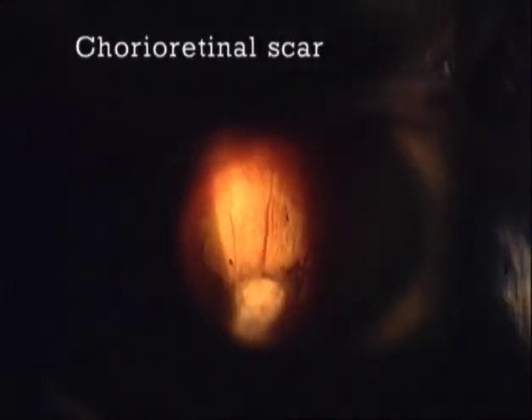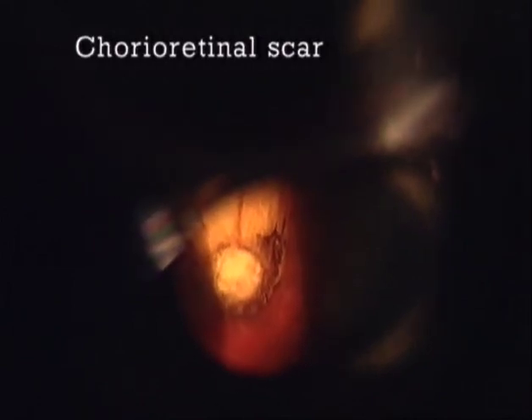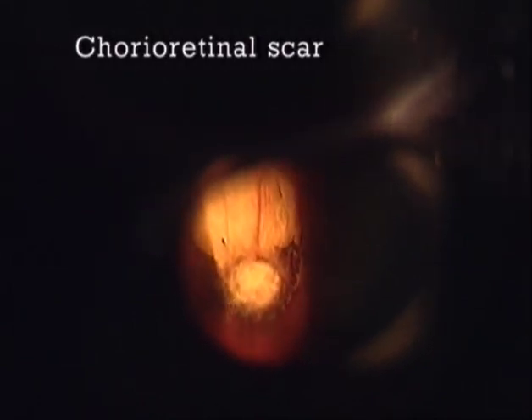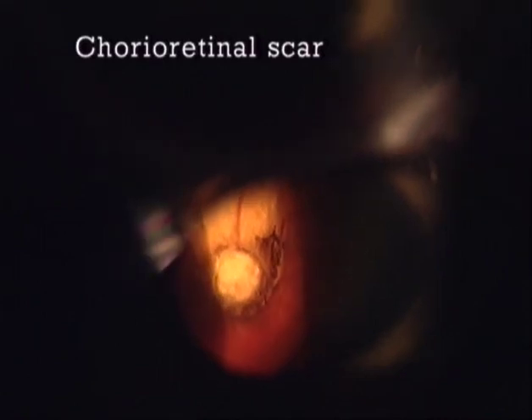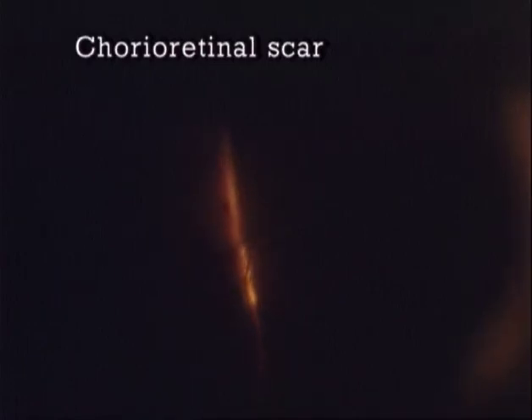Alternatively, as shown here by the example of a chorioretinal scar with circular vitreoretinal adhesions, the optical knife can also be used to disprove an elevation in cases of suspected tumor. At first glance, the round lesion within the scarred area seems to be a prominent nodule. The optical section, however, is straight and proves the entire area is flat.